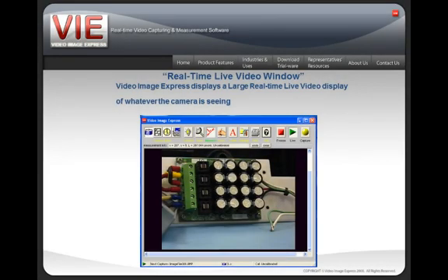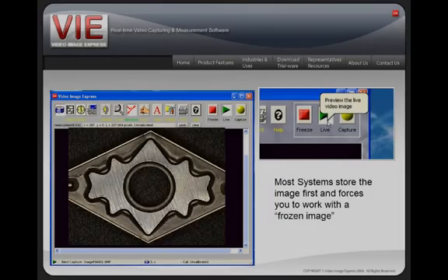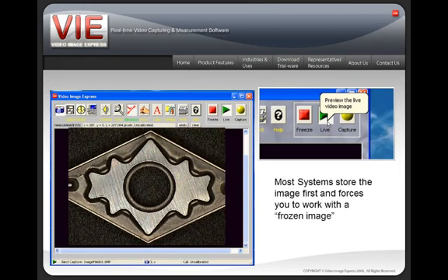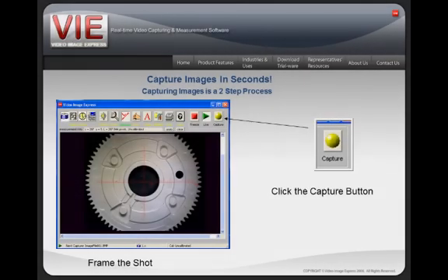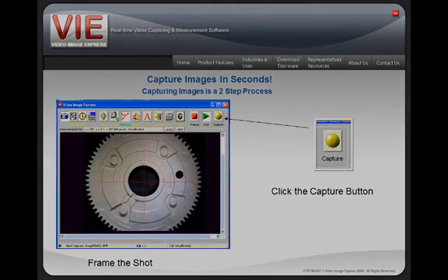One of the major advantages of Video Image Express is its ability to display a real-time live video window. Most systems force you to store the image first, but Video Image Express allows you to frame the shot live and then simply click the capture button. Framing and capturing is a two-step process.